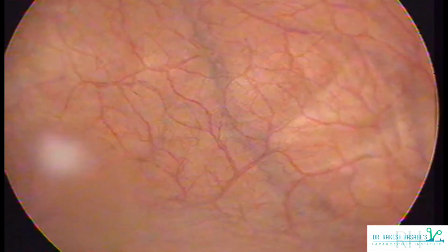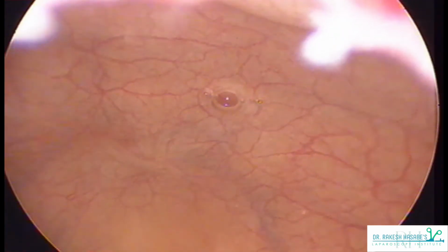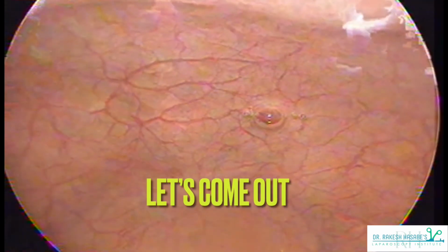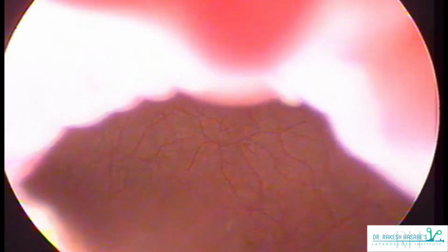The area that you are seeing presently on the screen is the bladder dome. I have also examined all the lateral walls of the bladder as well, and now that marks the end of my cystoscopy. The ring-like structure that you are seeing on the screen is the bladder neck, and slowly I'll come out of the bladder.